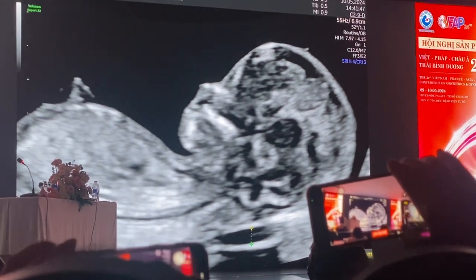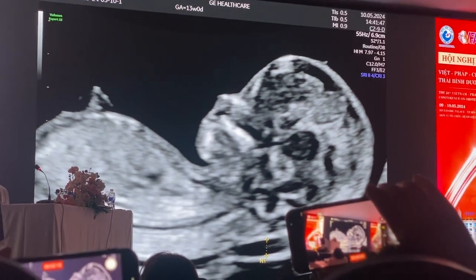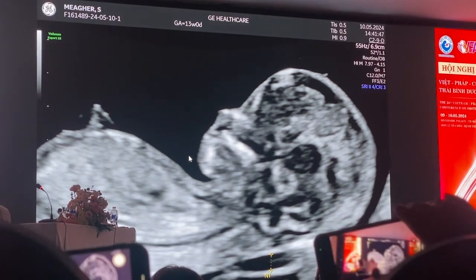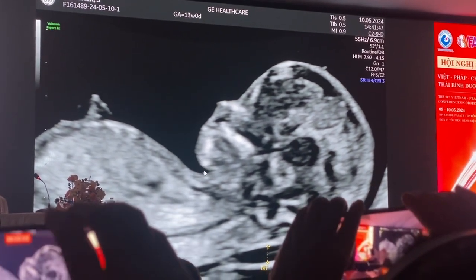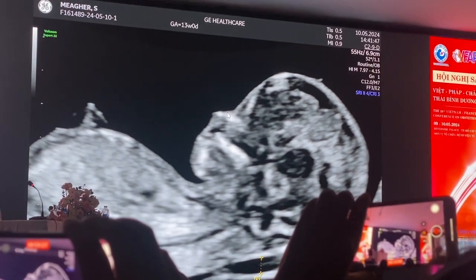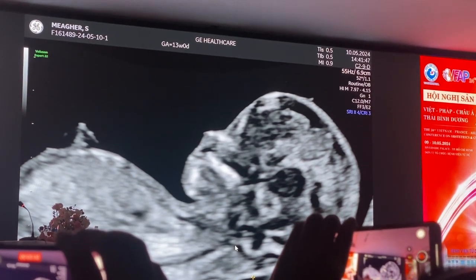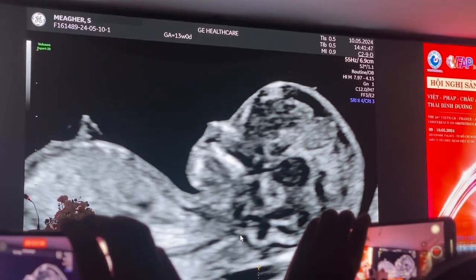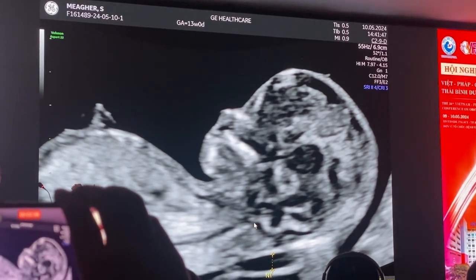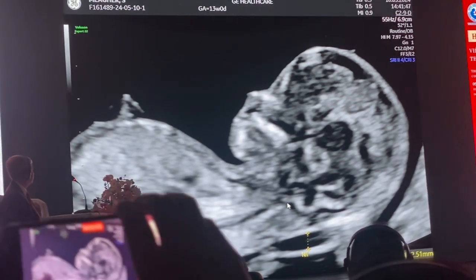And you can see that the fetus is firstly in a horizontal position. So this is important for the ISUOG guidelines. There's fluid underneath the chin, so the fetus is in a neutral position. It's a perfect mid-sagittal section because I have the nasal bone, and I have an adequate magnification. So this is an acceptable nuchal translucency measurement of 2.5 millimeters at 13 weeks gestation. And I save that measurement to the drive as a single image.